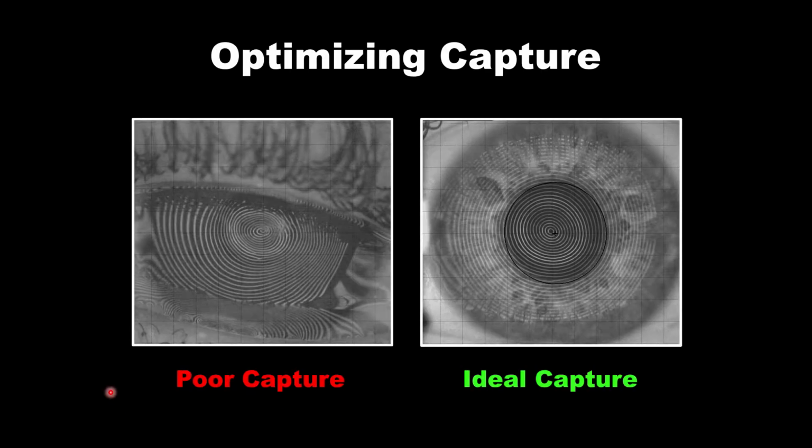First, we must begin by getting an accurate, ideal topography. And here we can see on the left, fissure size is an issue, the eyelash shadows are a problem, the rings are distorting, we've got a huge tear film wedge at the bottom. So these are the kind of things we want to avoid. The image on the right shows a more optimized capture, where we're covering most of the cornea, the lids and lashes are out of the way, and we can call that a good initial image.